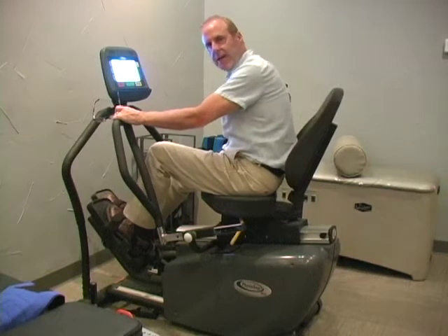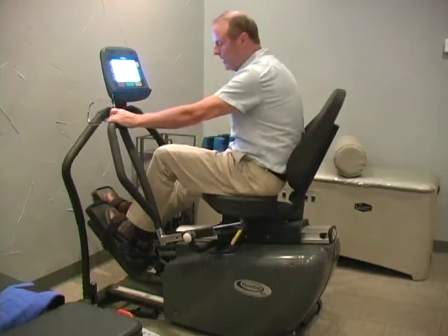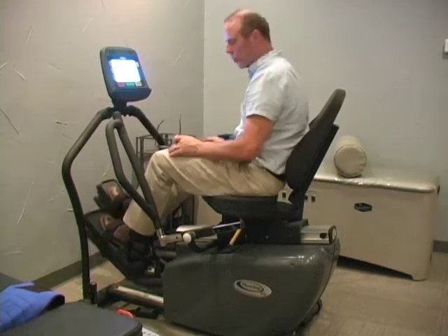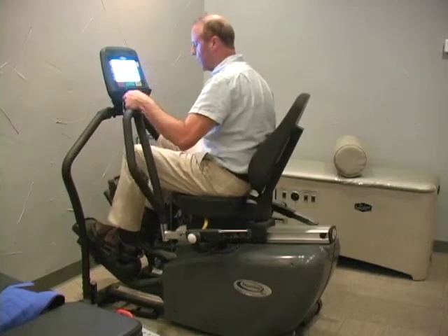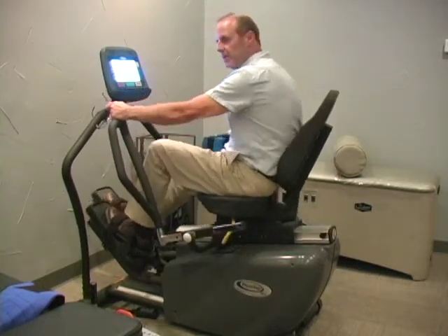If the seat needs to be adjusted, there's a yellow handle on the right side which will glide the seat forward or back. You want the legs to have near full extension. For a shorter patient, slide the seat forward; for a taller person, slide it back.